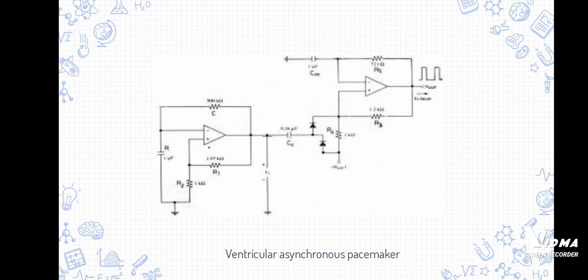If it is fixed in the atrium, it beats at a fixed rate. If the ventricle beats at a different rate, it leads to severe problems, and ventricular fibrillation may occur.